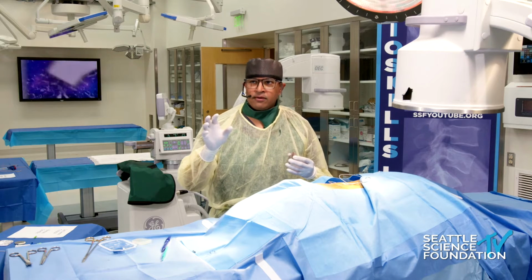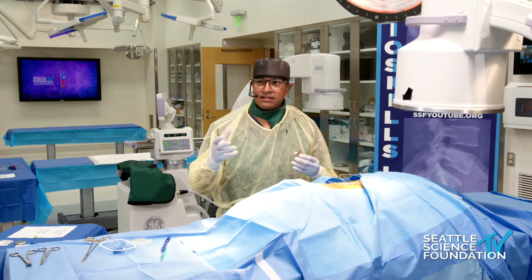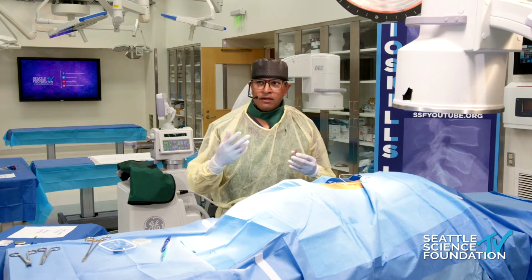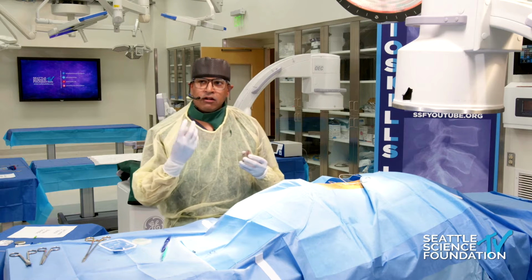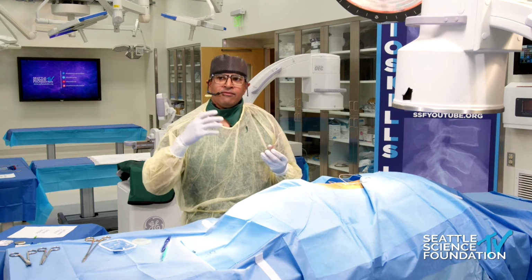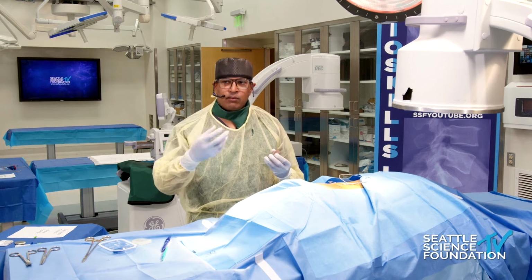And we know from the data from Pope and Van Buyten that a number of these stimulators do get explanted, and the number one reason really being a loss of efficacy, a loss of therapeutic benefit. There are other reasons too, of course. Lower on the list is infection, lower on the list is you need an MRI, but the loss of therapy is really important.